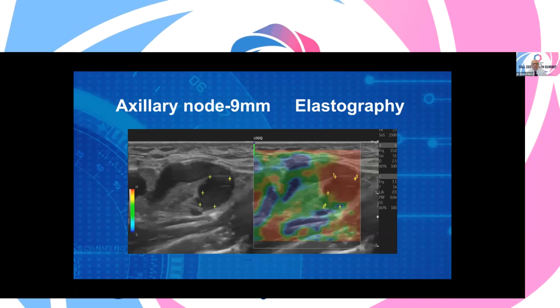And in this case, the malignant lymph gland, the part that's cancerous, shows up as a bright red focus. Of course, you can biopsy this, and when we do the blood flow ultrasound, it lights up again with blood vessels, and this showed up on the thermal imaging, which is why we got to it.